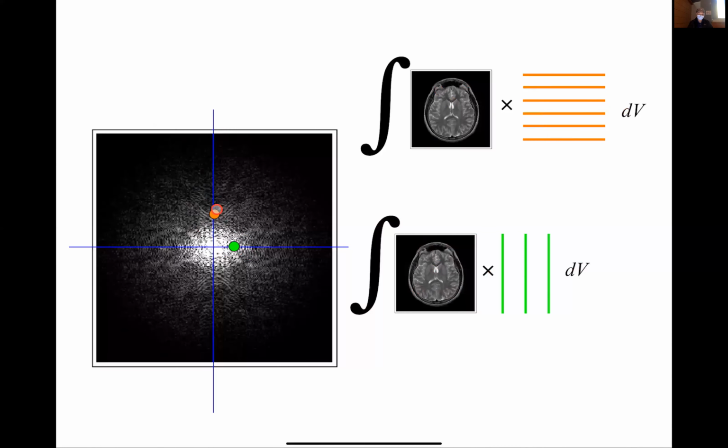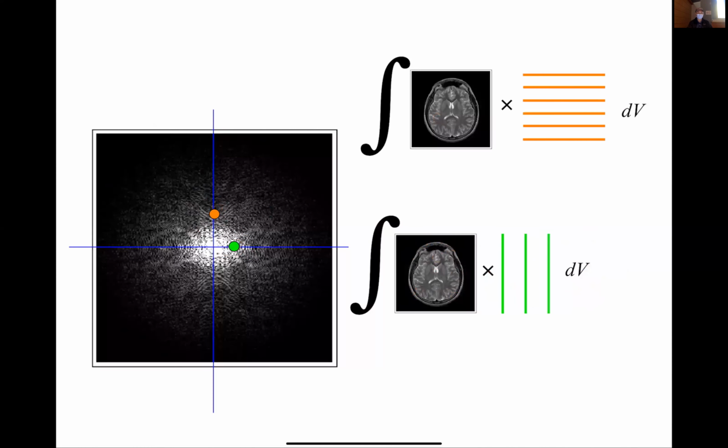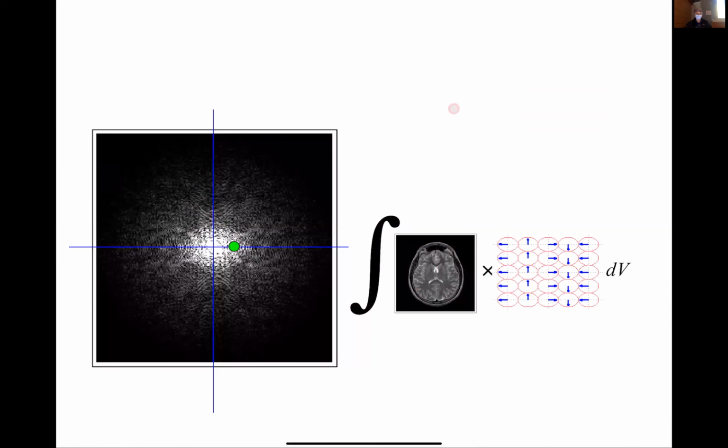If we look at the same thing with phasors, if we were doing this mathematically, we would take my object and multiply by this phasor pattern, and you can see this has variations in x, but no variation in y. I do this, and this is what it gives. So that's actually the calculation we do. The previous view is a very simple way of looking at it, but in reality, we use complex phasors in the equation. This is the complex phasor pattern. So that's what we do mathematically.